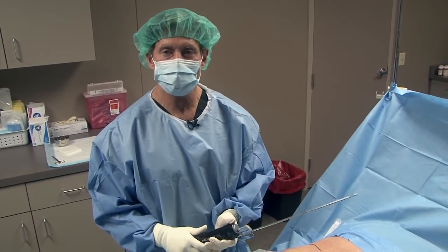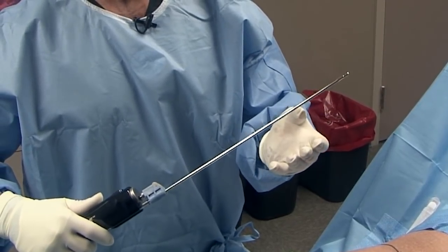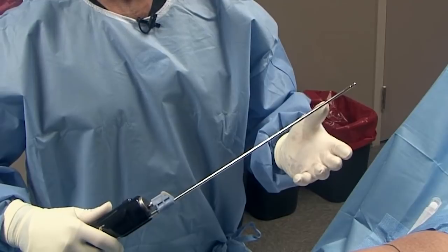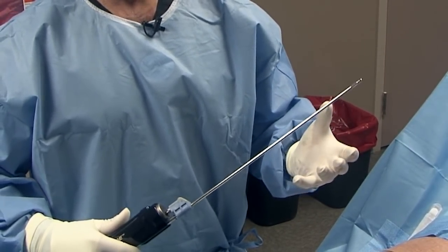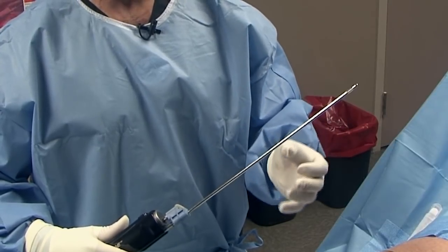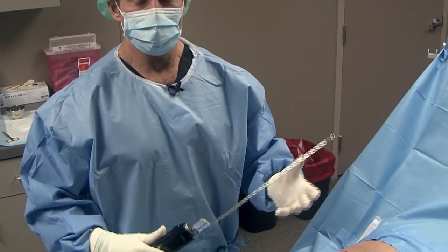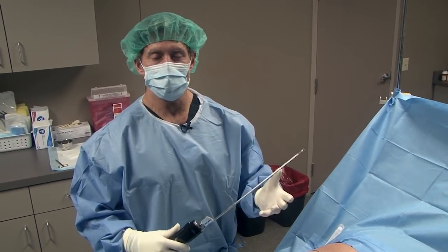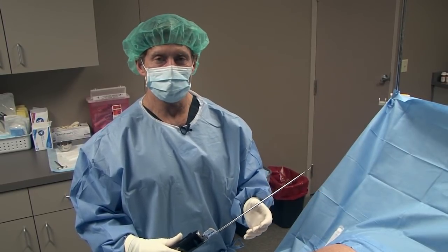You don't have to do this part — it can all be done with laser — but this just gets us a much nicer result. This is called power-assisted liposuction. This is a very small tube, as you can see. It is a little bit larger than the laser, but it's still small. A lot of people have seen liposuction on YouTube or TV, and the regular liposuction tubes or cannulas they use have a much bigger diameter. They cause a lot more trauma than this, so there's much more bruising and discomfort after the procedure than there is doing it with smart lipo and power-assisted liposuction.